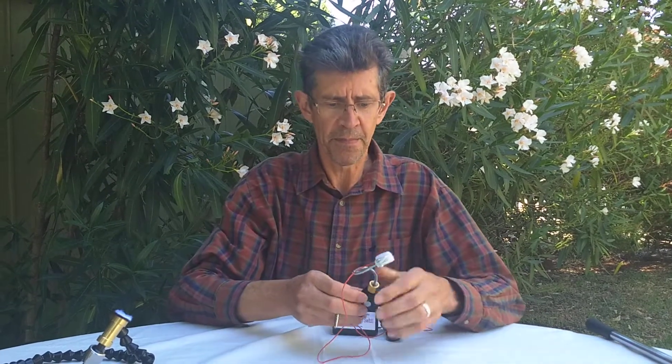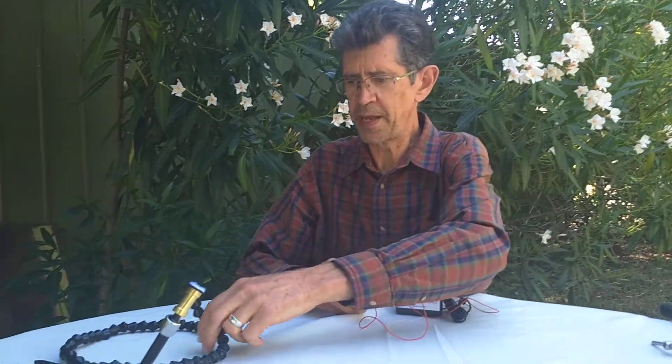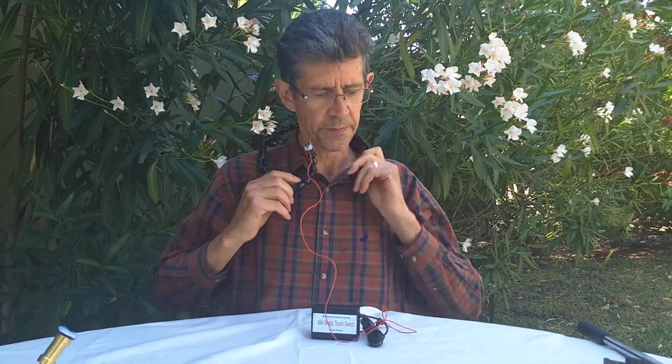That's option number one for our mounting — the mini flexible gooseneck. Another flexible mount is this neck mount. This is great for sitting up in a chair or lying back in bed, and the mount travels with you.